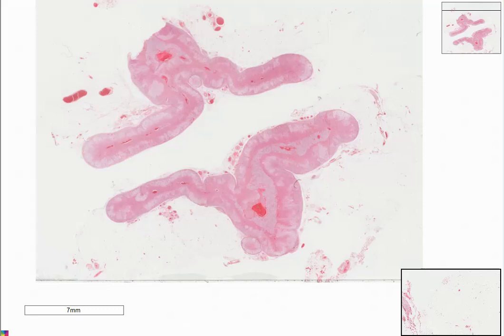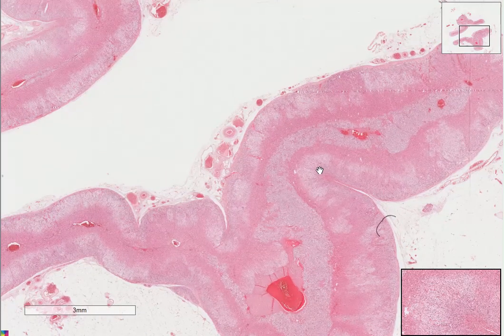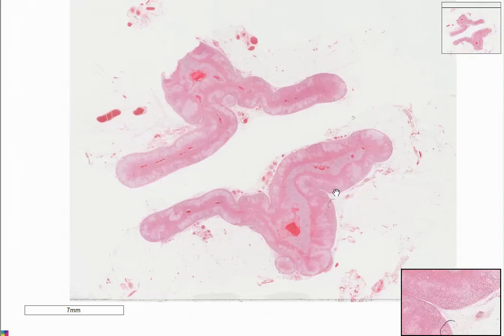Hi everyone, today we're looking at the adrenal gland, and this is a fairly easy organ to remember. It shouldn't stress you out. And if you're given this in an exam, I'm sure you'll get this 100% correct in its identification and stating why it is an adrenal gland, just based off of this video. But for greater detail, you need to have a look at your textbooks, your prescribed histology textbooks. Anyway, let's dive into this nice gland.